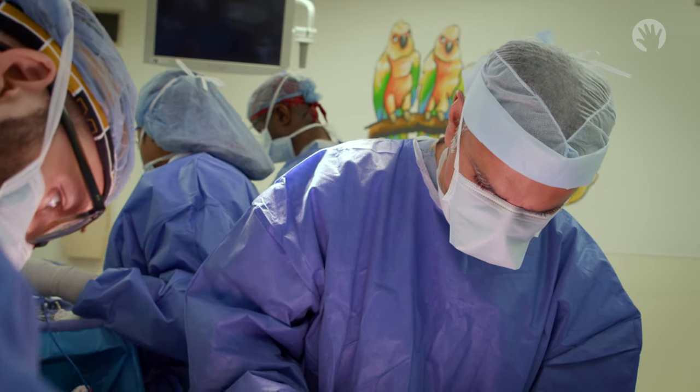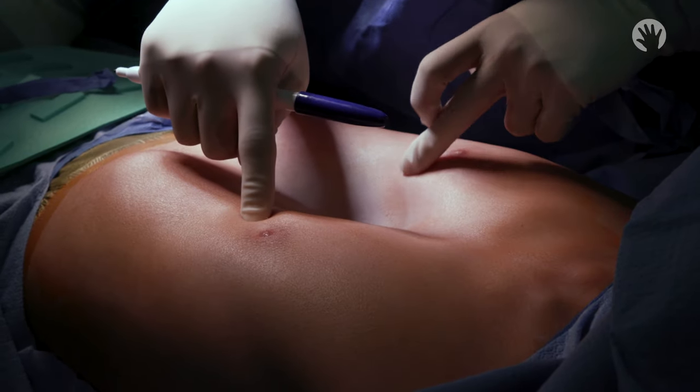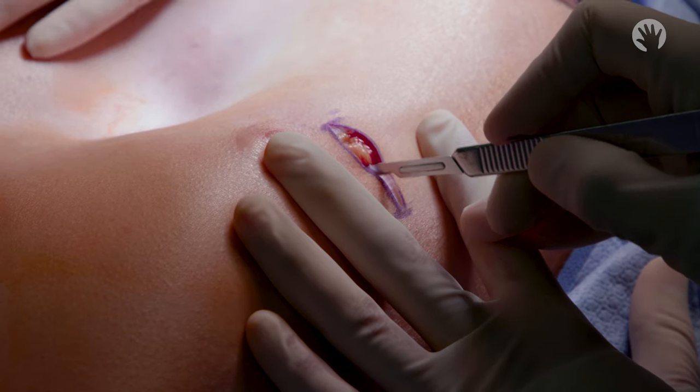Today I'm going to take you through the steps of the operation to show you how we do it. First, we make two small incisions about four centimeters long on each side of the chest.